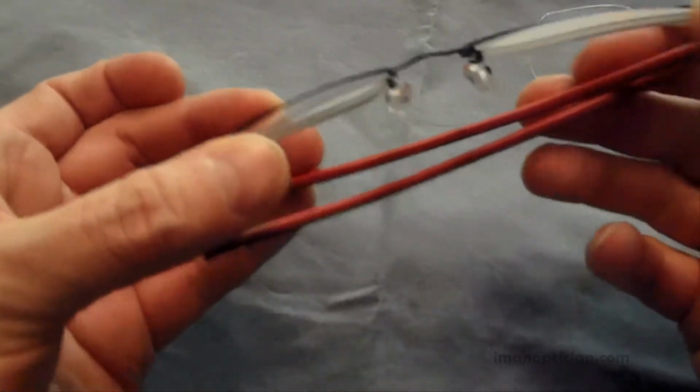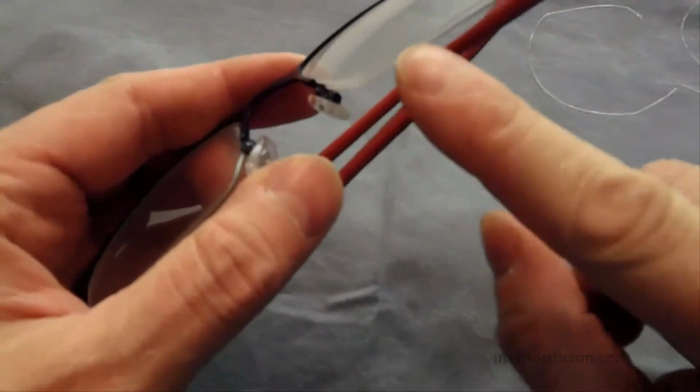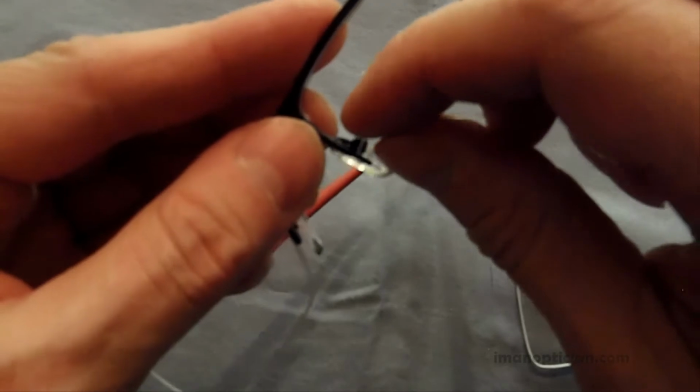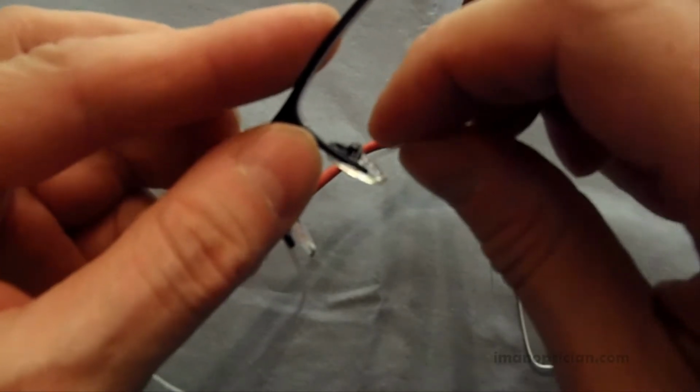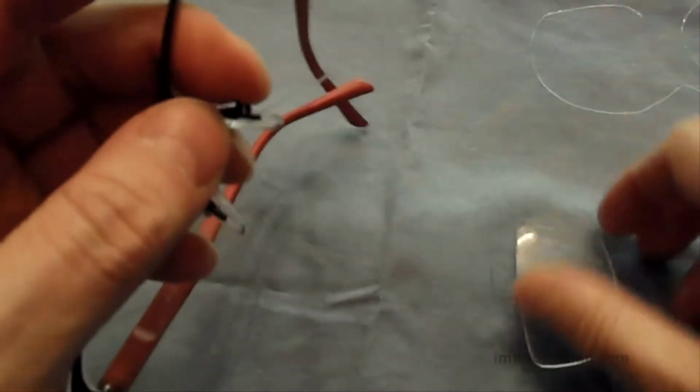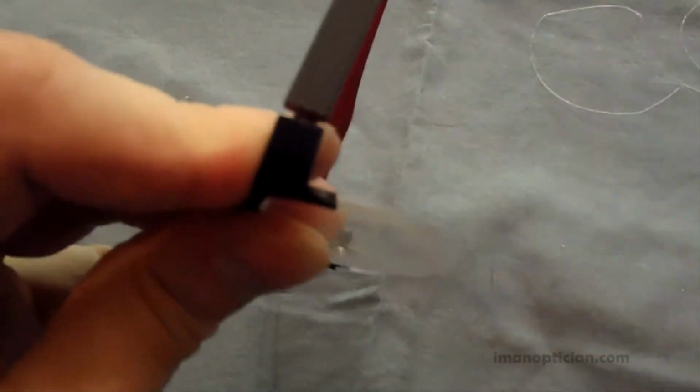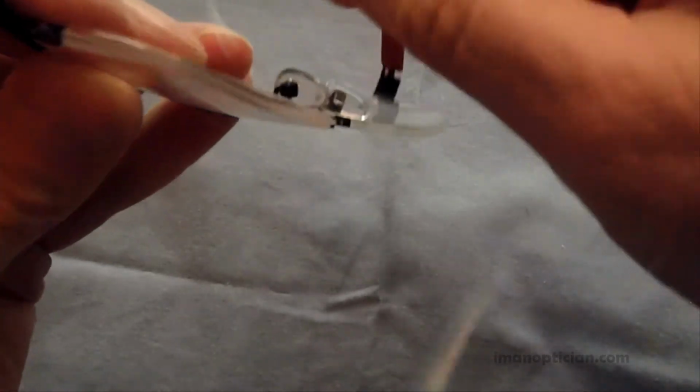Nice and easy. Now, if this is too short, what you need to do is take this and push it back a little bit. You can take your tag and push it so that it's out just a little bit, and you've got a little bit of leeway on this side, a little bit on that side. You can pull it out either side and loosen up the string a little bit. If your string is a little bit too loose, you can do the same thing and just pull it a little tighter and cut the tag off a little bit.